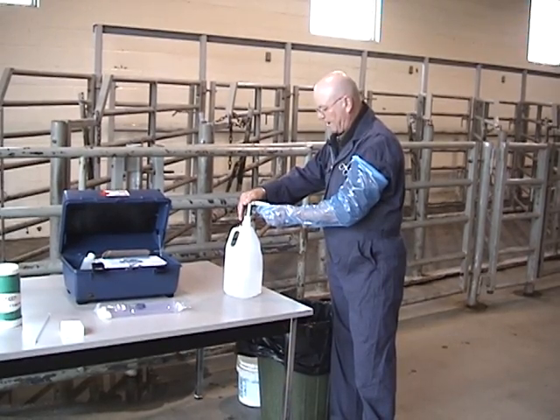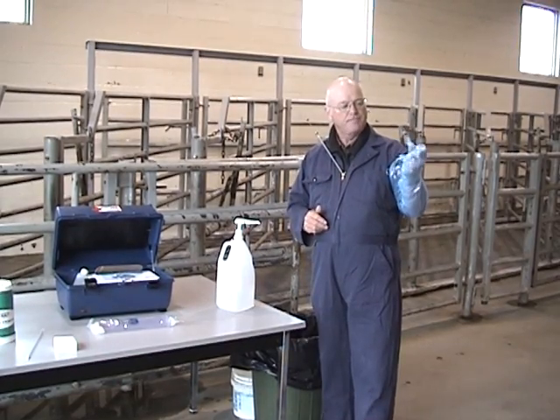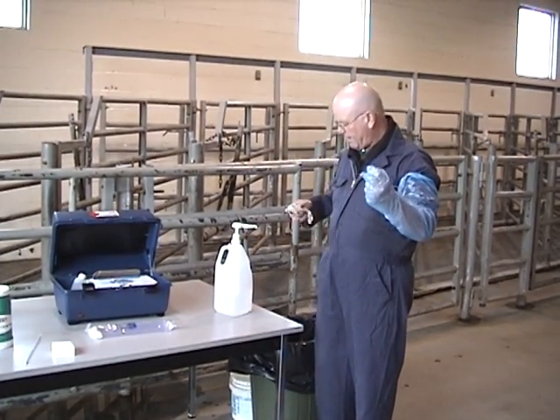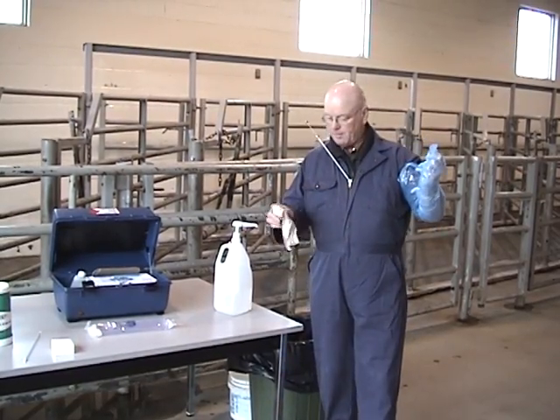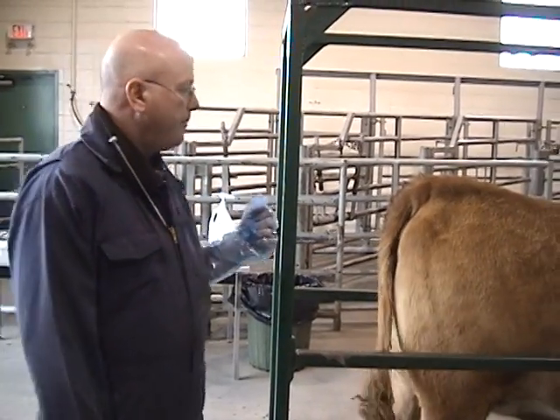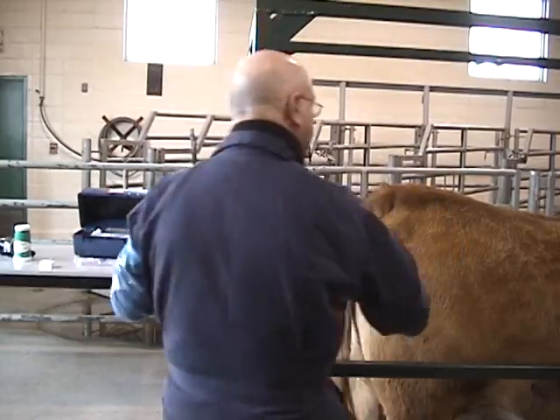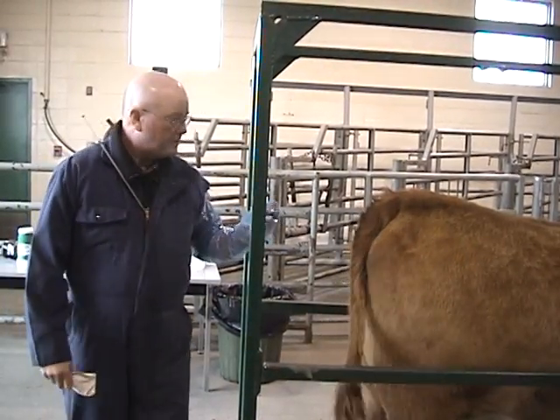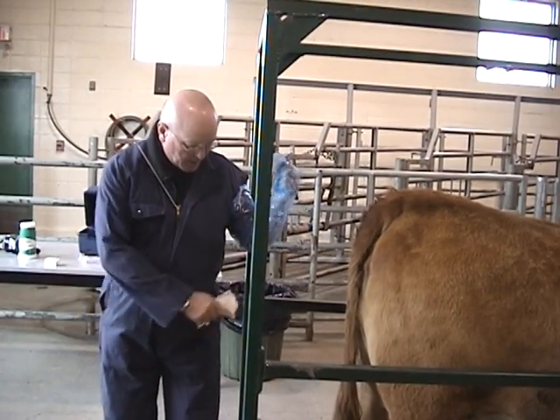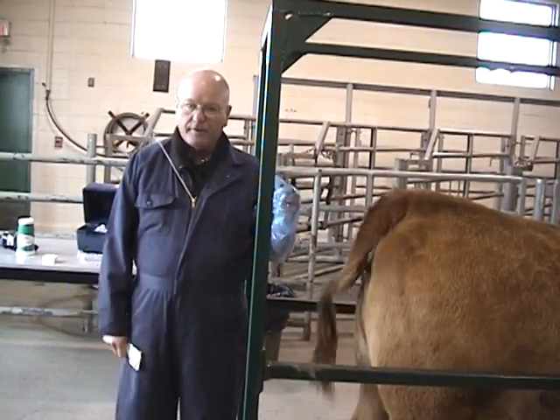I'm going to put just a little bit of lube on — it won't need much. Just work it in between your fingers of your glove hand, and I'll have a paper towel ready to go. As you're approaching the cow, it's important that she knows you're there so you don't spook her and she doesn't try to kick back. Once I stand behind the cow, I'm going to stand sideways to her so if she throws her boot it will go in front or behind me, and I'm offering less of a target.